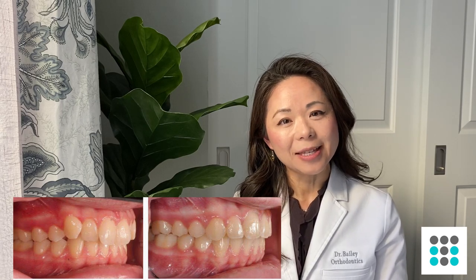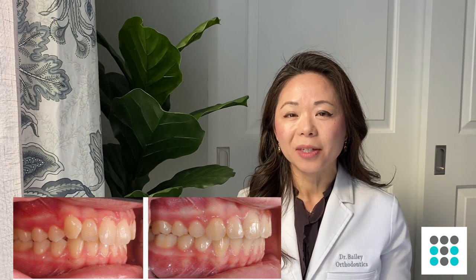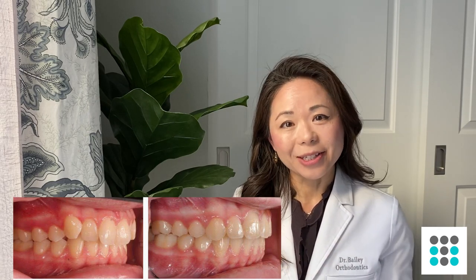Your top teeth have peaks and valleys, kind of like gears, and you want the top and the bottom to fit together properly like gears. That's basically what rubber bands do — they pull your teeth on the top and bottom in such a way so that your teeth match up.